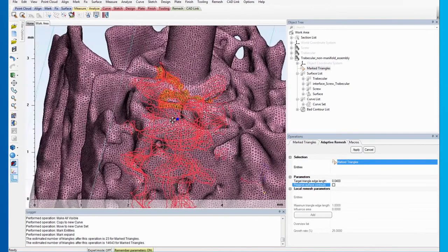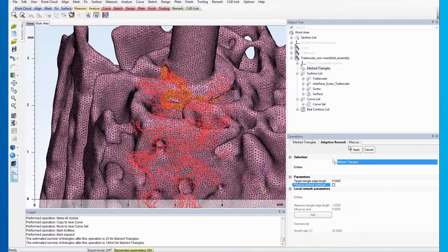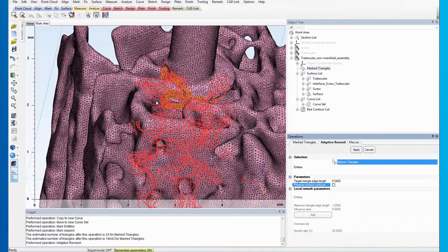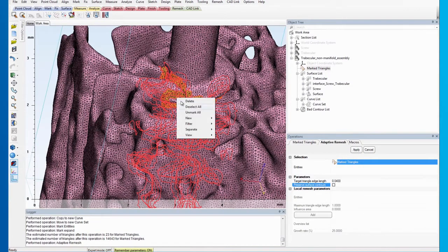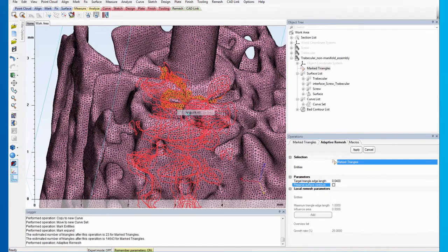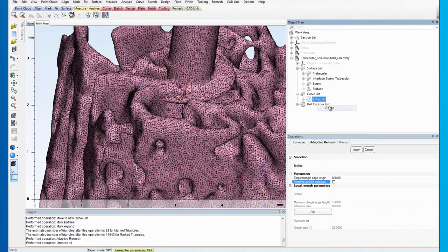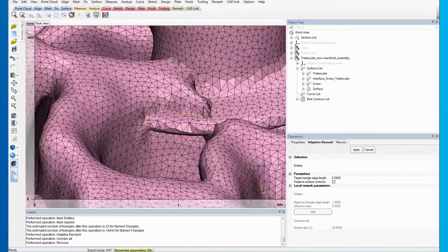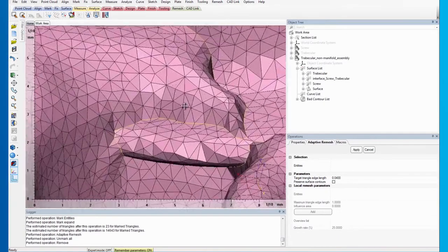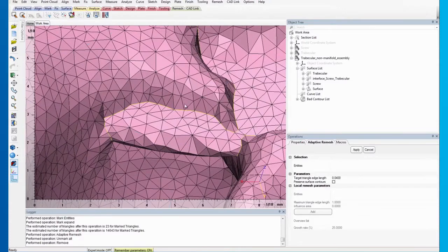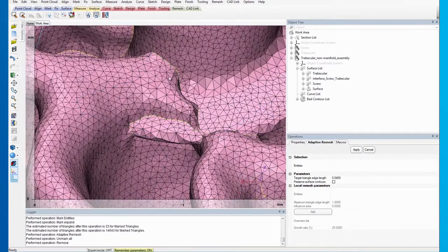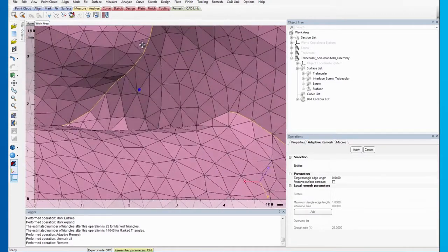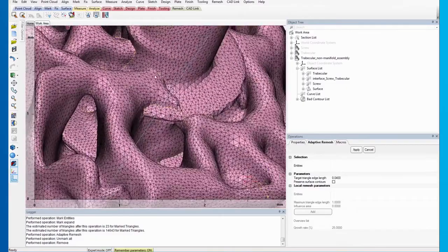Make sure that the marked triangles are selected as entities and set the target triangle edge length to 0.04 mm. Uncheck the Preserve Surface Contours option. After remeshing, right-click the work area to select Unmark All and proceed to delete the curve set from the object tree. Now, you will see that the triangles are much more regular and uniform across the bed contours.